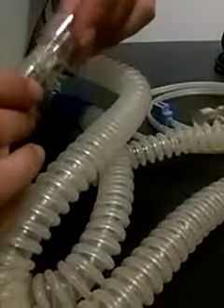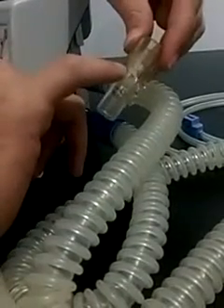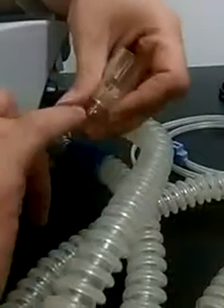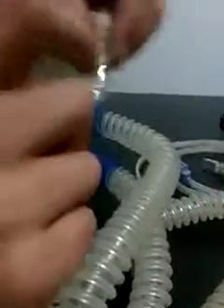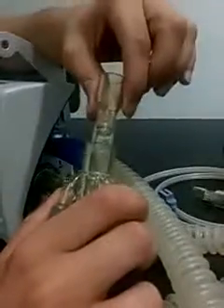How can you define the flow sensor for adult or pediatric or neonate? Here you have, like here, ADU, that means adult flow sensor, or it could be INF for infant, or NEU for neonate. So when you are using an adult circuit, you need an adult flow sensor. You connect the flow sensor to the white piece and then connect the cable of the flow sensor with the equipment, and now it is ready to connect to your patient. You connect your patient from here using a tube or masks.